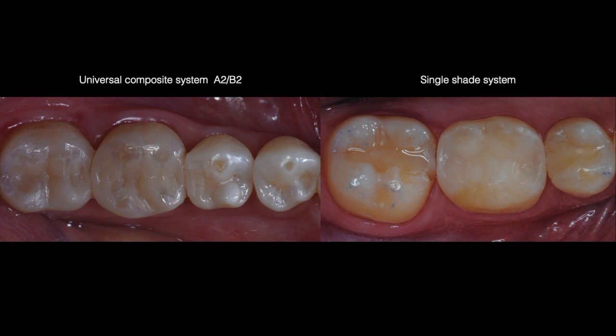I do want to mention that my observations and clinical experience with both materials is that the intrinsic opacity of Brilliant Everglow helps tremendously in regards to mimicking color when there is a lot of tooth structure missing, like in the following case.